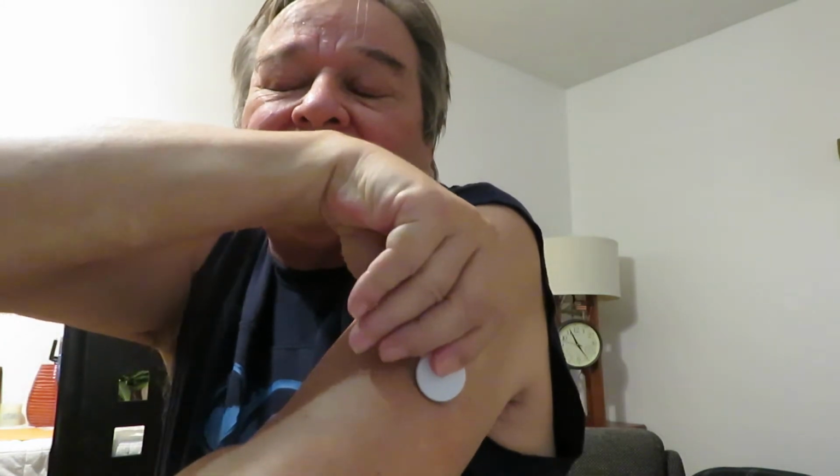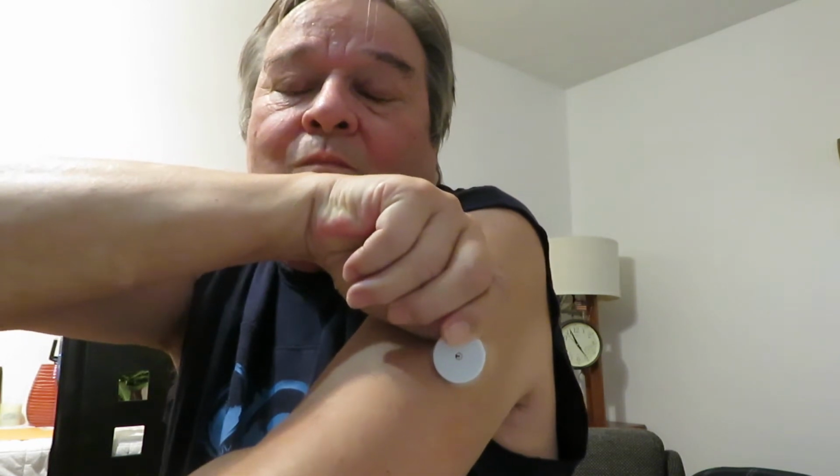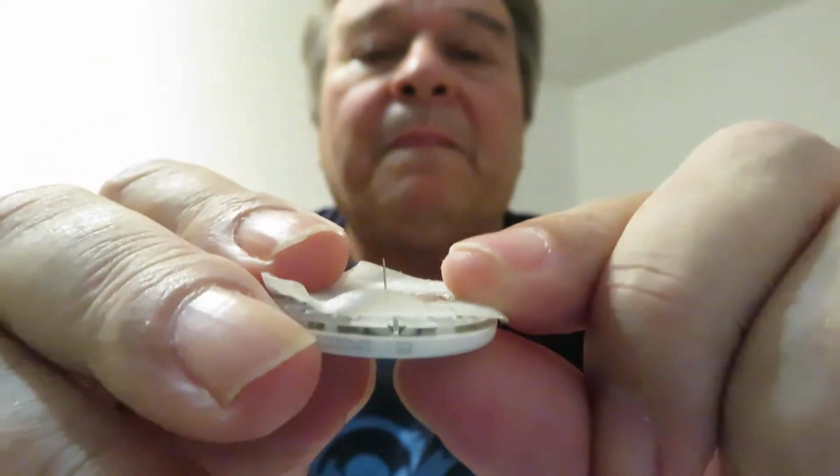Let's see. It's coming off. Pull it up like you did pulling up pieces of grass when you were a kid. Okay, sometimes it leaves the sticky stuff on your arm, but it didn't this time, and there it is. Whoops. Didn't feel a thing. Throw that away.